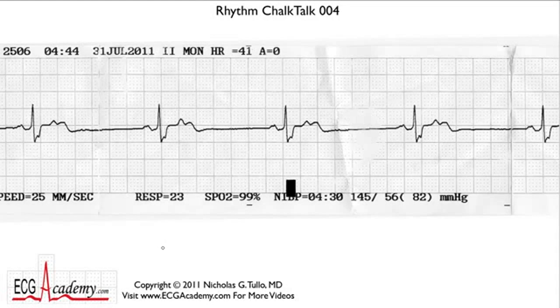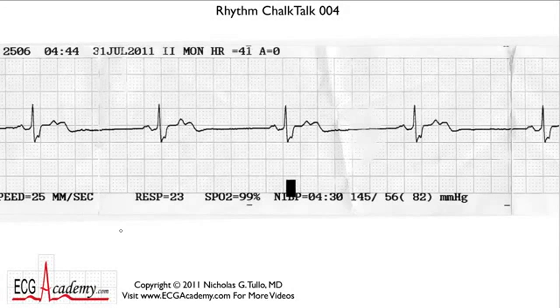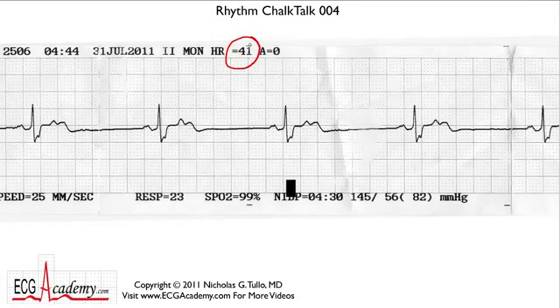This one is an intermediate one, certainly not as bad as the last one. Let's give you a little clinical background. Imagine this patient is being monitored for some post-operative problems, and the nurse calls that the patient has all of a sudden developed a heart rate of about 40 beats per minute. You have to look at the EKG and figure out what's going on.